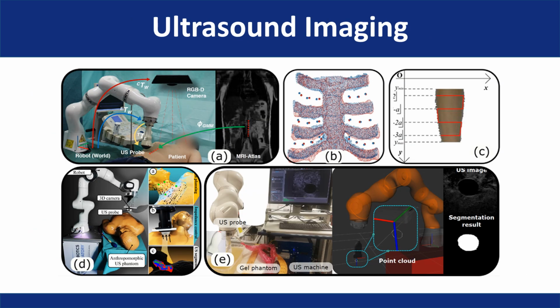Ultrasound imaging. So let's look at this picture here, which illustrates various approaches to scan path planning in robotic ultrasound systems. Path planning is vital for ensuring the robot effectively covers the area of interest, either for diagnostics or interventional purposes. The figure showcases both offline and online methods.